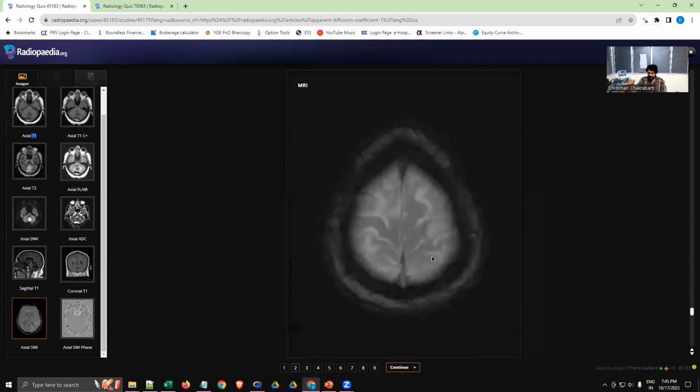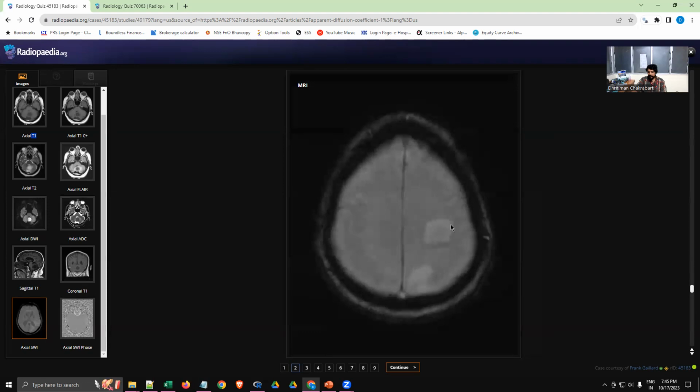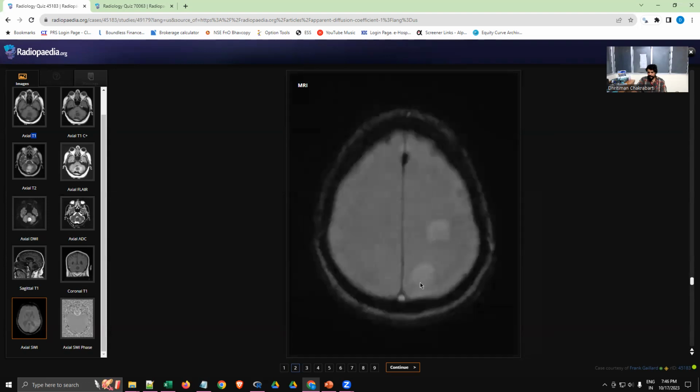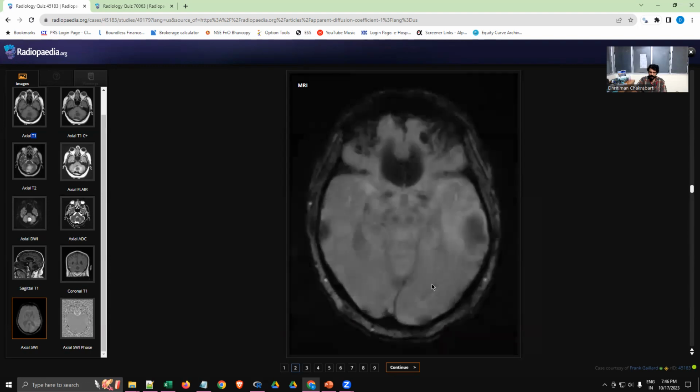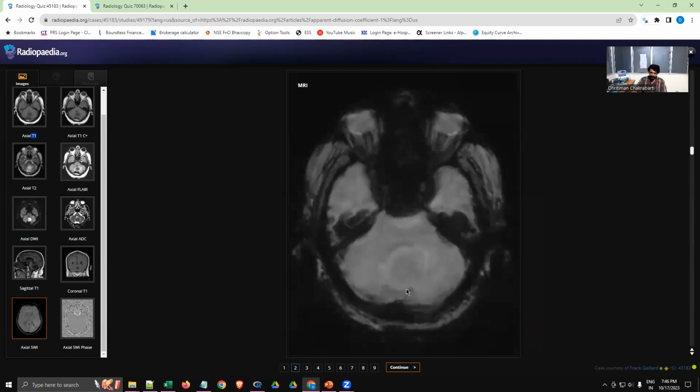That is it actually. Like you can make out that inside these edematous areas or inside the lesions, there is no mineral deposits. That's all you are able to make out from the SWI images in this patient. Okay, so that is how you read the MRI.